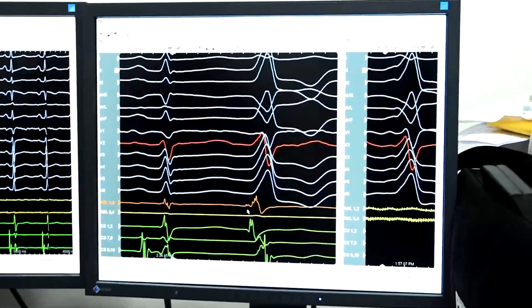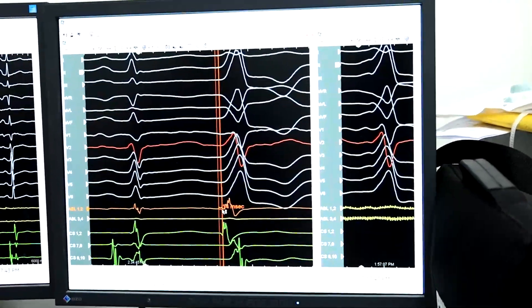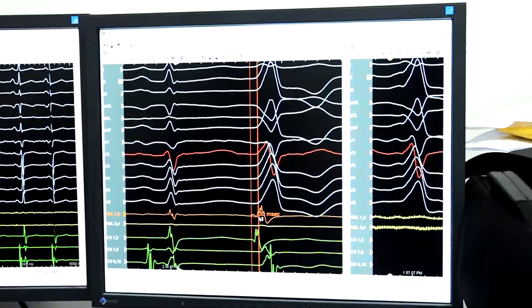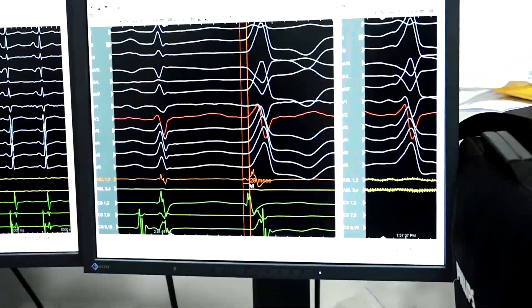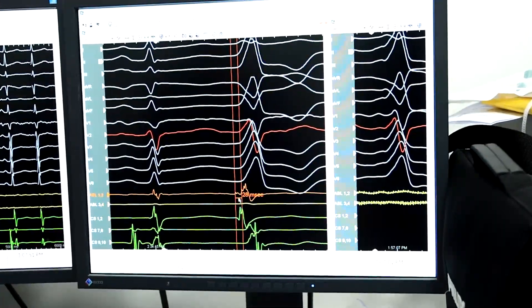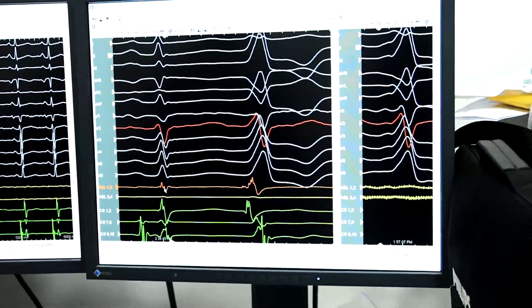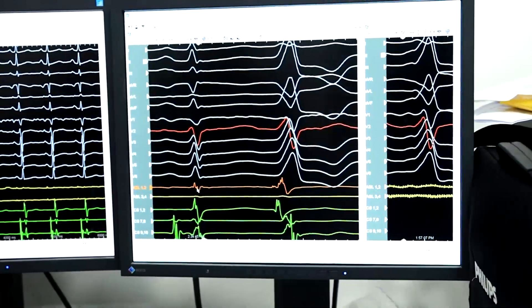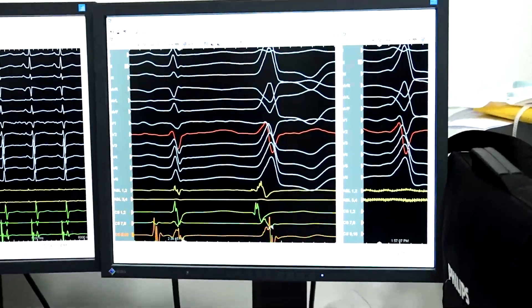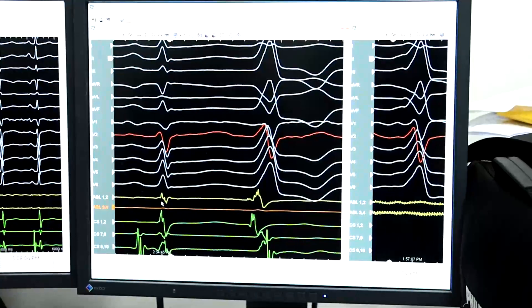Seeing such a location at the commissure between the right coronary cusp and left coronary cusp, we got a nice potential that precedes even the coronary catheter and precedes the QRS complex by about 28 milliseconds. And even the sinus electrogram showing a very sharp potential representing a myocardial sleeve here.